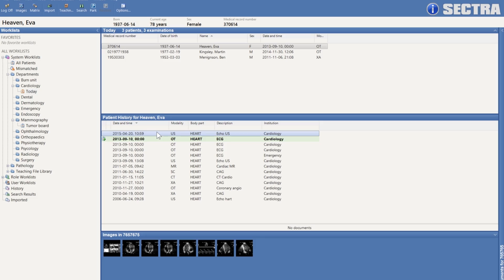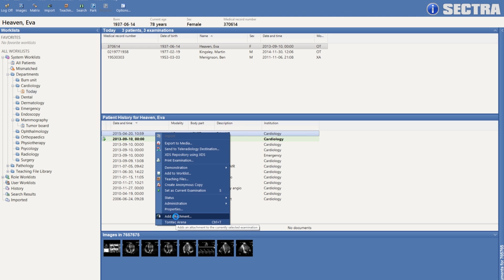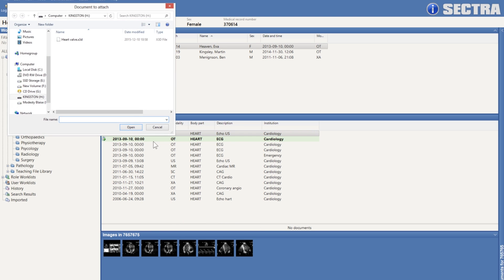True enterprise imaging is actually not only about images. Sometimes there may be a need to ingest other types of files. To do that, we build on the XDS document standard to be able to be generic and insert essentially any type of file format. I simply add an attachment, and here I have a CAD drawing built to be able to bioprint a heart valve.